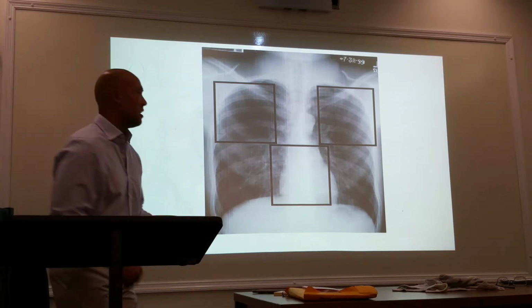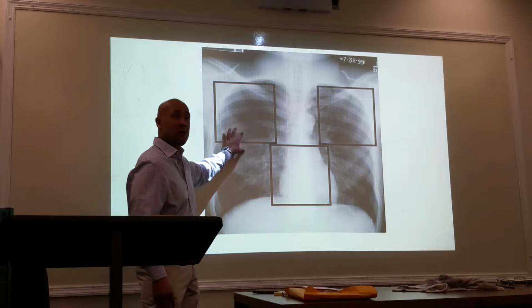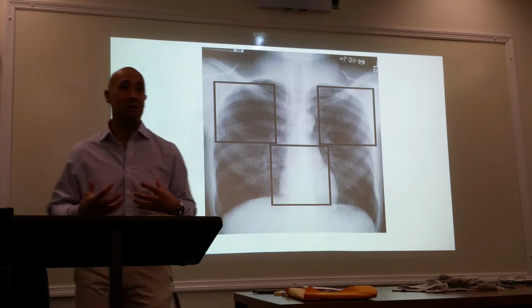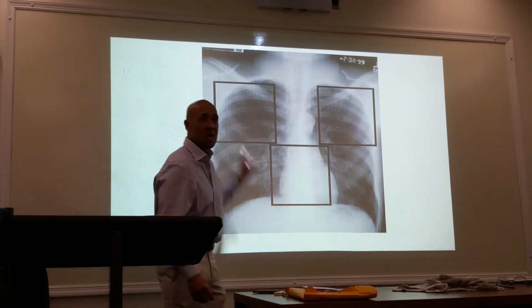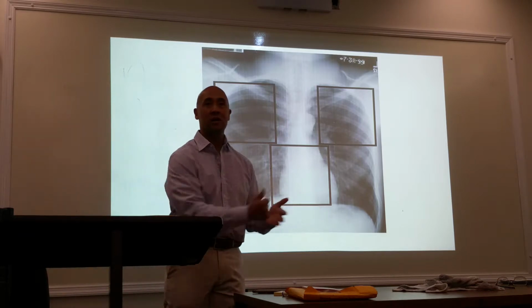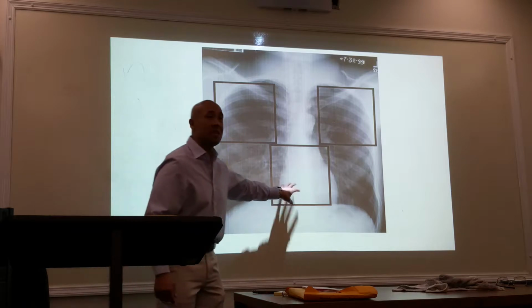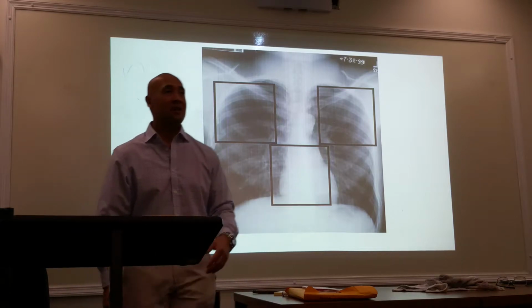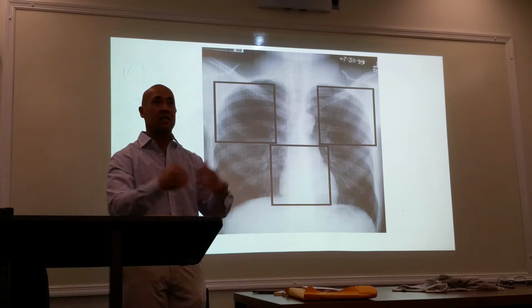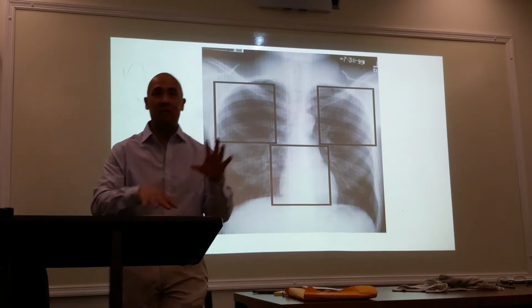What I'm saying here is you want cells to cover an airy area, and you want to cover an area that has some density to it. If you're just shooting the airy area, X-rays are just going to go right through it, giving you a quick exposure. If you're just shooting a dense area, it's going to take longer to penetrate, so you'll have a longer exposure. So if you do one of each, it'll average it out.